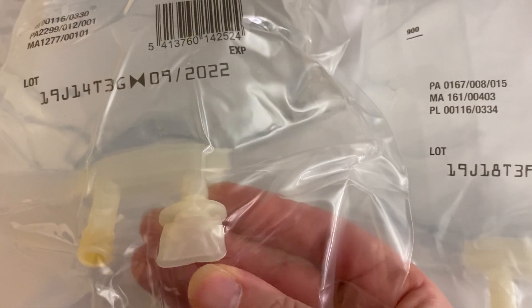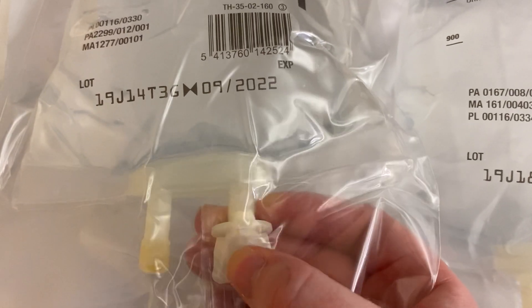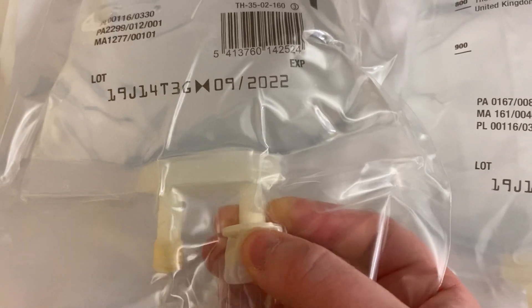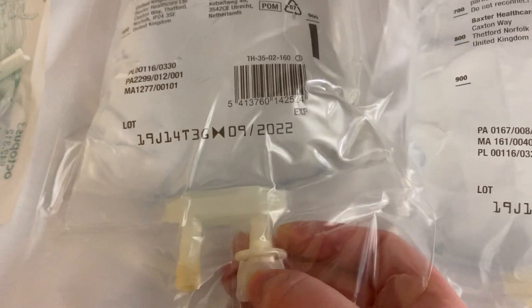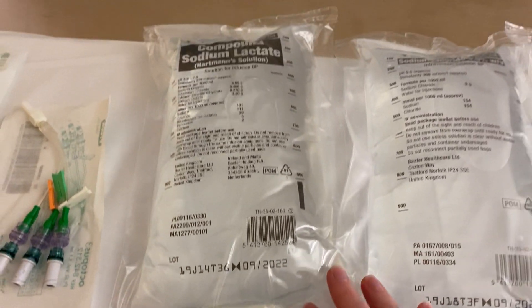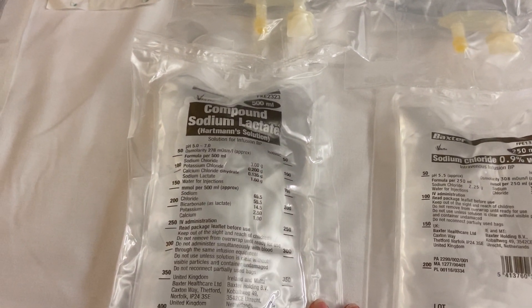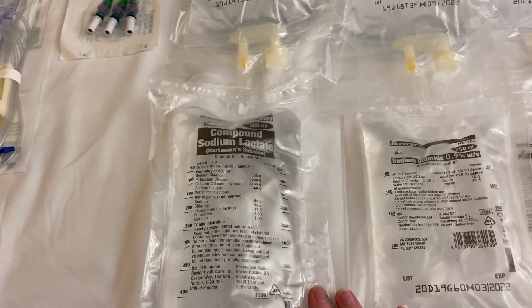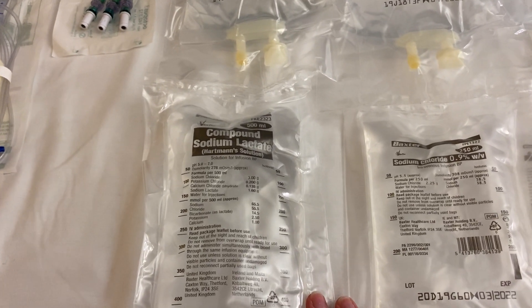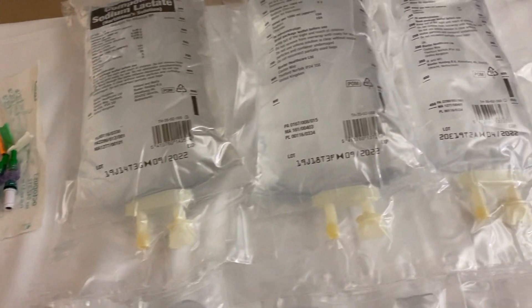The device on the side is where you spike the bag to attach your giving set — this little tab comes off and your spike goes all the way in to drain the fluid out. That's a one-litre bag of Hartmann's. There's also a 500 ml bag of Hartmann's — that's all we usually have, because if we're giving drugs we tend to give them in saline or dextrose.